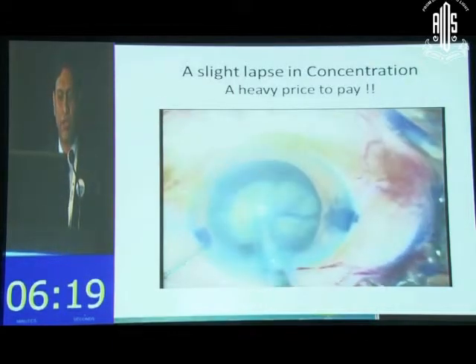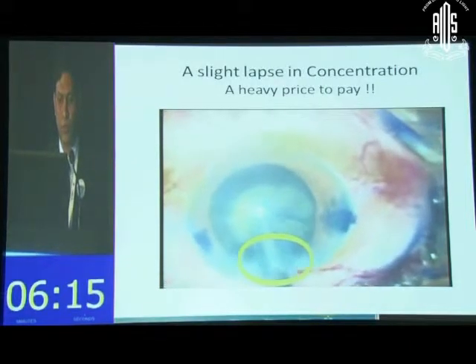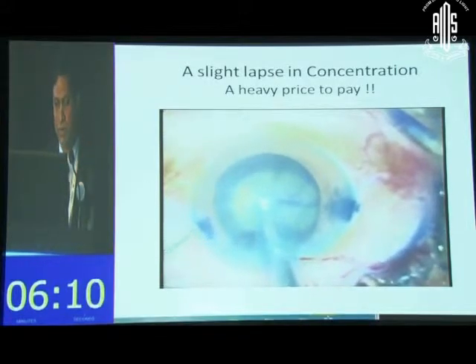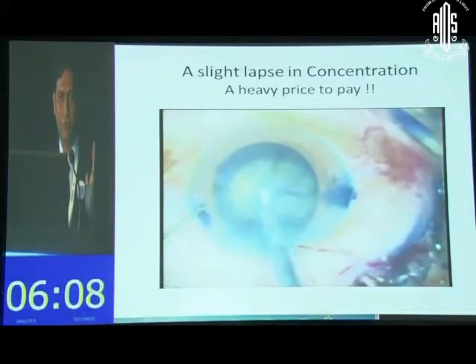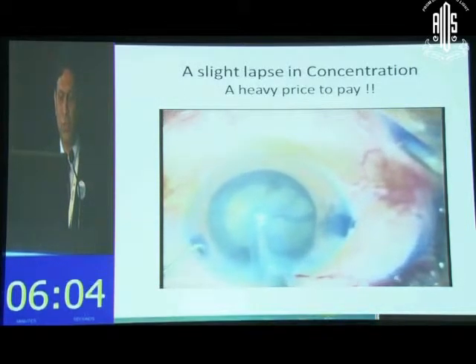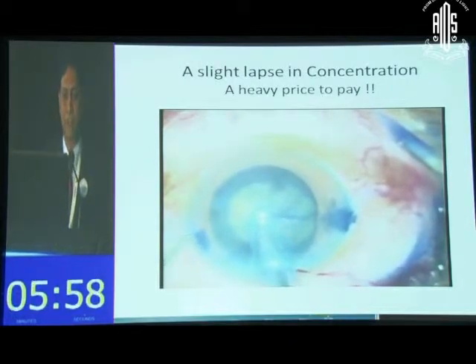So I have put in Healon, stabilized that nucleus over there. Watch that phaco probe and the wound over there. I am not looking at that at all. I've got Healon packed in my chamber, and I'm going for a direct chop. I want to minimize the rocking of the nucleus. I'm really not looking, and I forgot that there was Healon in the anterior chamber. That's what tension can do, anxiety can do.